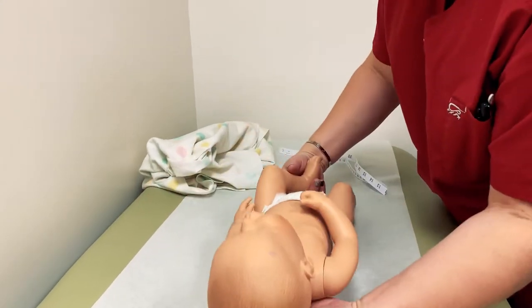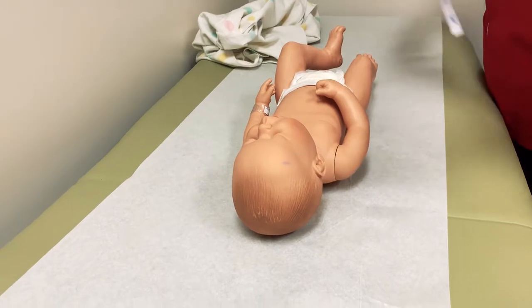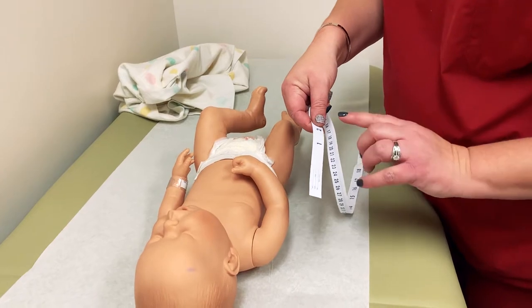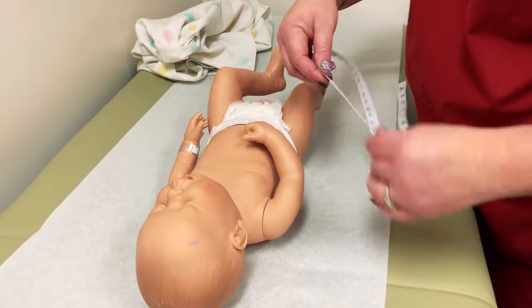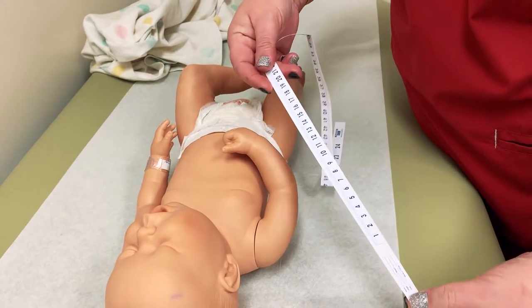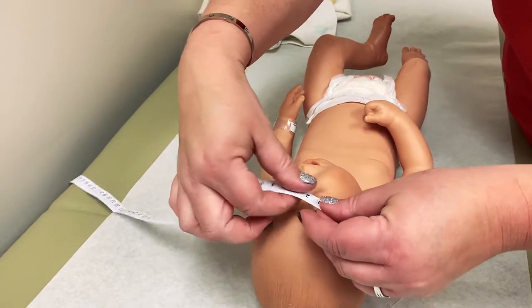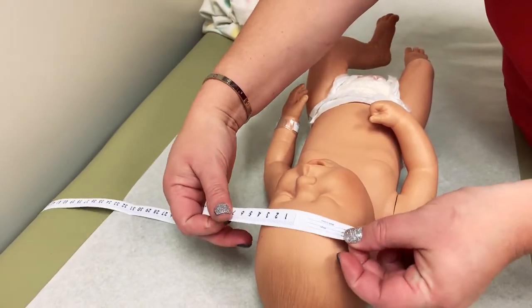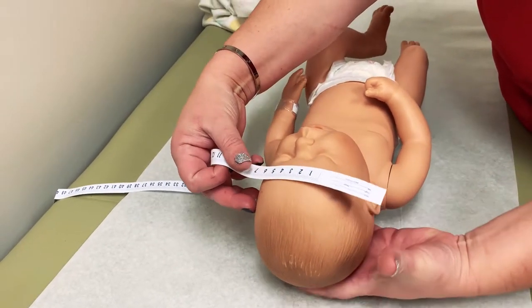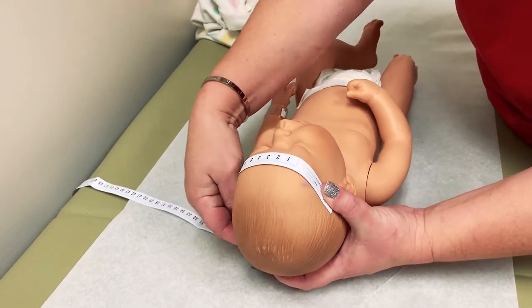We start with the head circumference by taking the measuring tape. Whether or not your provider prefers inches or centimeters, typically the tapes will have both options, one on each side. You want to make sure that you are measuring around the largest portion of the infant's head. Also, you want to make sure that you are supporting the baby's head entirely as well as their neck when you are lifting to get the band around.